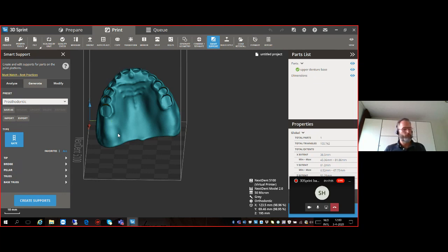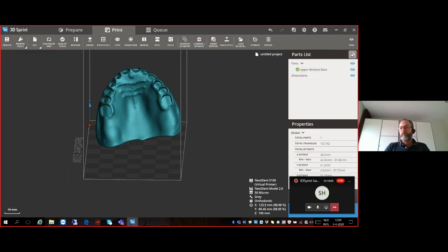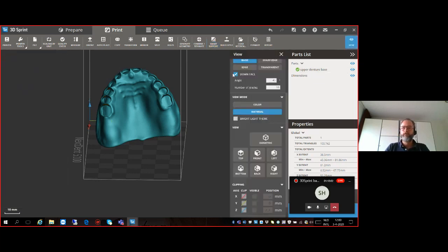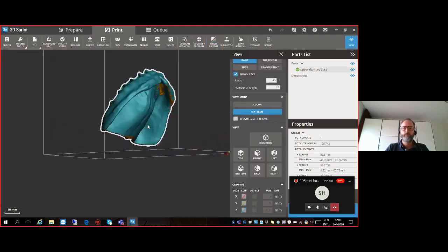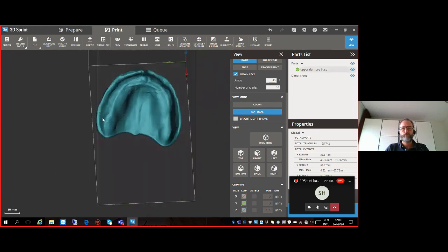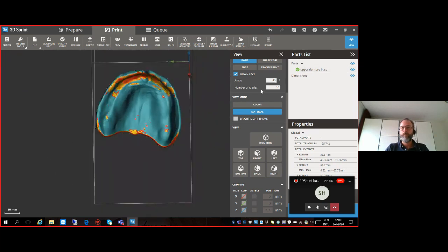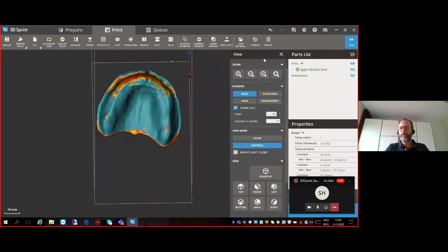To find the Down Facing Surface view again: go to the View menu and you'll see the Down Facing button there.